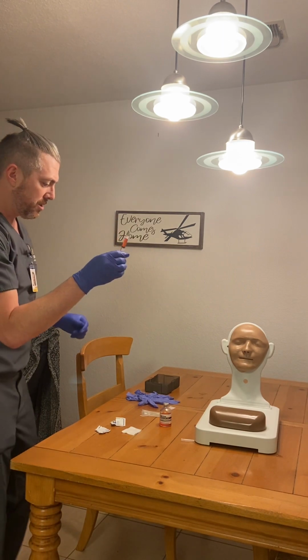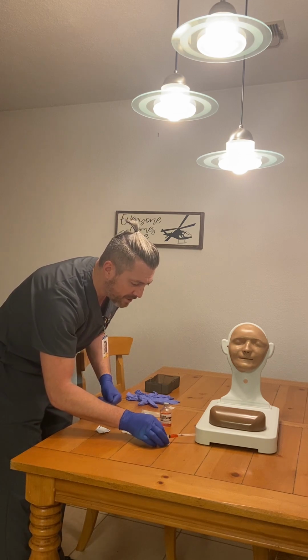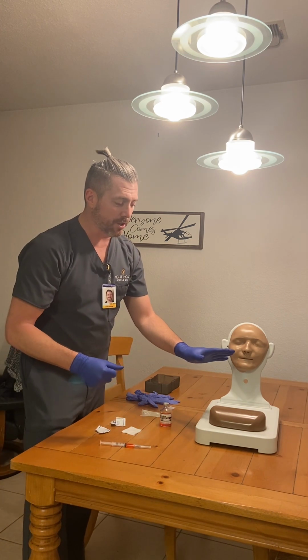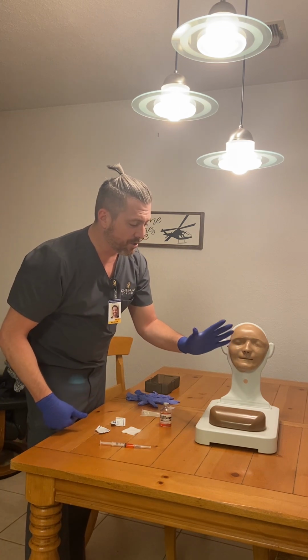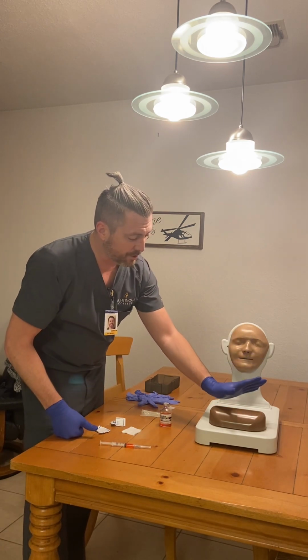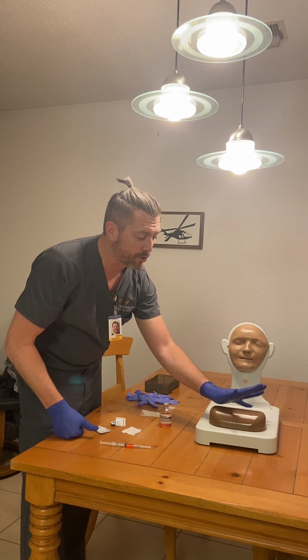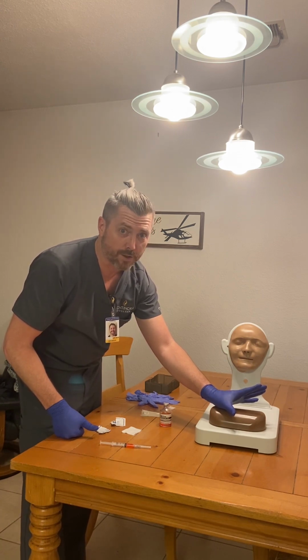of the morphine sulfate. So I'm going to do the scoop method here to recap this. I'm going to put this down on a clean surface, and we're going to look for our site now. Our site is going to be the ventrogluteal area on the patient. To find our anatomical position, we're going to put the heel of our palm on the head of the greater trochanter, with our pinky finger pointing towards their buttock and the thumb pointing towards the front of the leg.